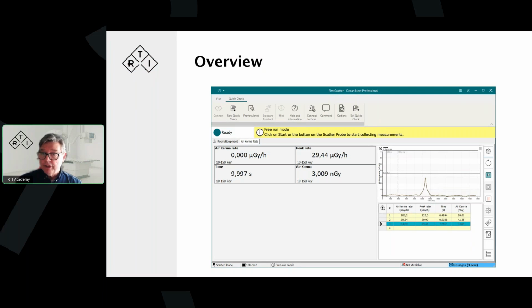When we tried free run, there was background radiation. After pressing reset, it was not getting 0. How to reset? Don't really understand the question here. There was background radiation. There's always background radiation, but the reset button that we're using, and which is, by the way, this button up here that I'm now circling on the screen, that's the reset button.